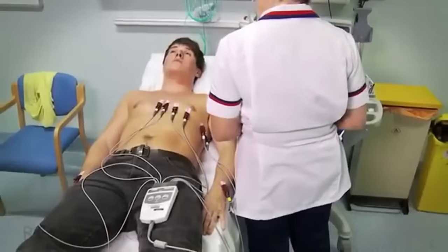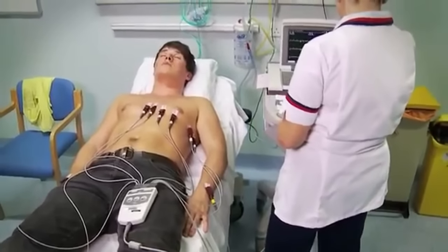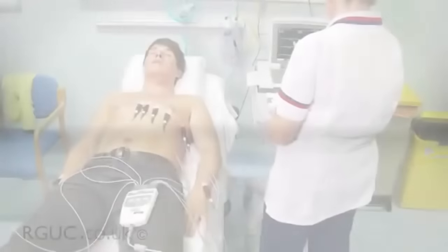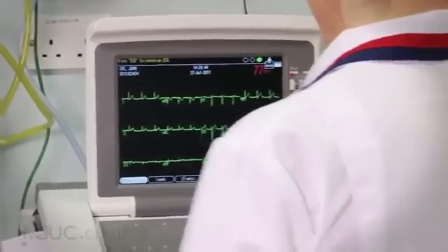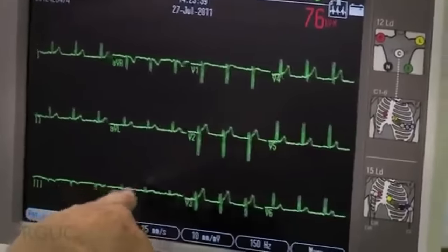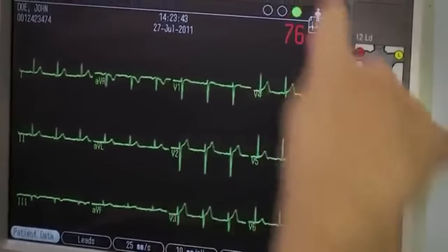Now the leads are attached, you're ready to take the ECG recording. If you have a female patient, you may wish to cover the chest to help maintain the patient's dignity while you proceed with the recording, ensuring not to disturb the lead attachments. Ask your patient to be completely relaxed and breathe normally. When you are ready to record, double-check your settings and check the screen to make sure that all of the leads are connected and producing a satisfactory tracing.